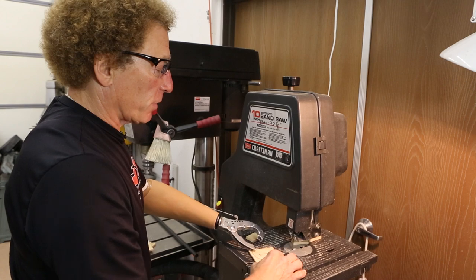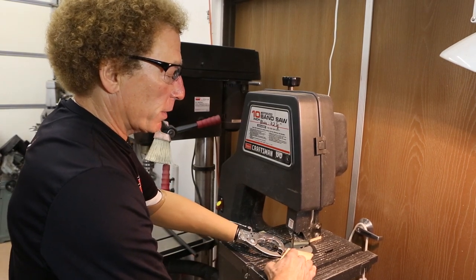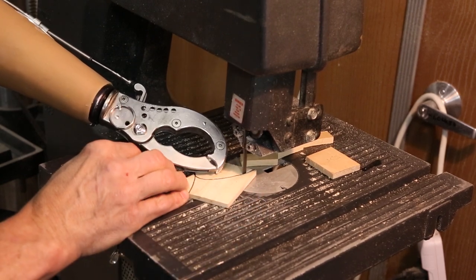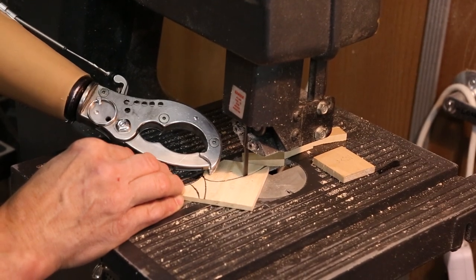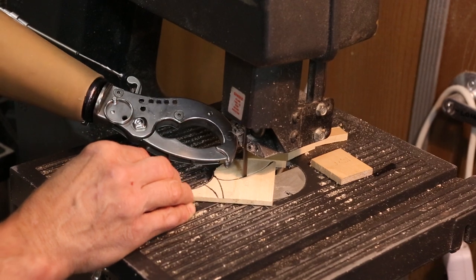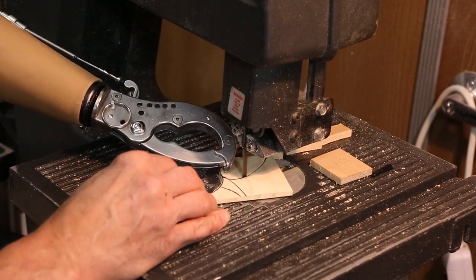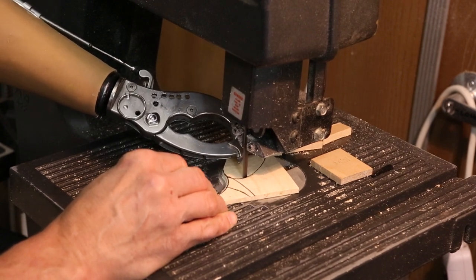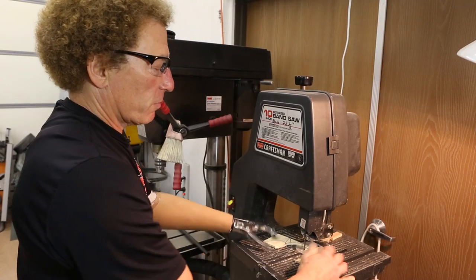I'll do another curve cut here — it's a little bit more intricate. I'll use the prehensor to help me steer and do a more complex type of cut. I also use the prehensor in many cases to shield my fingers when I'm in an area where I'm potentially in jeopardy. I'll use the prehensor to create a zone of safety for my hand.